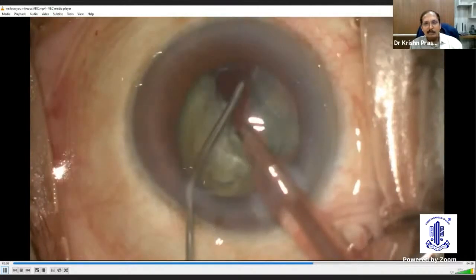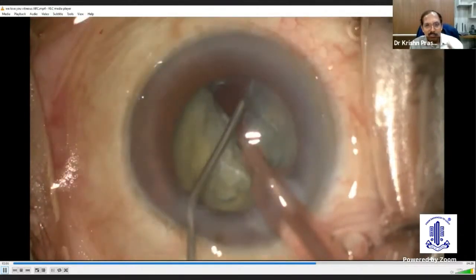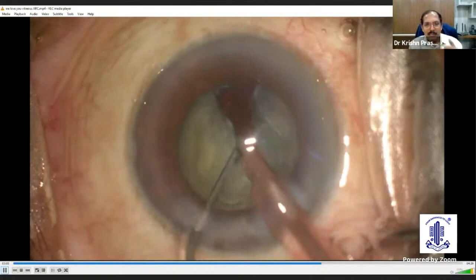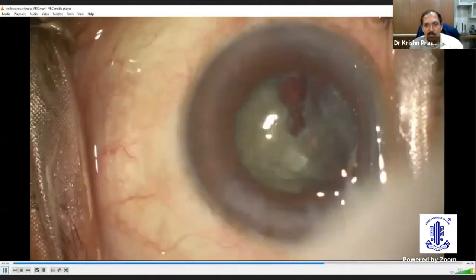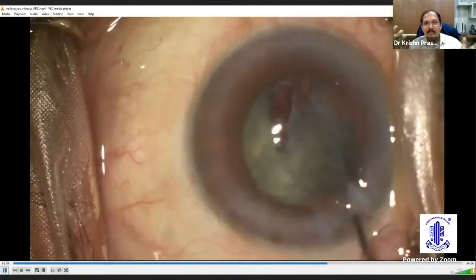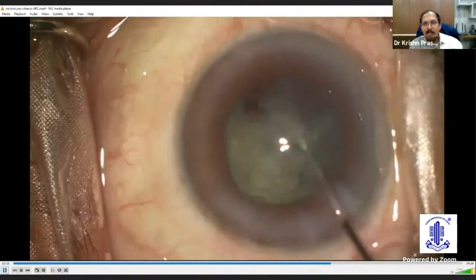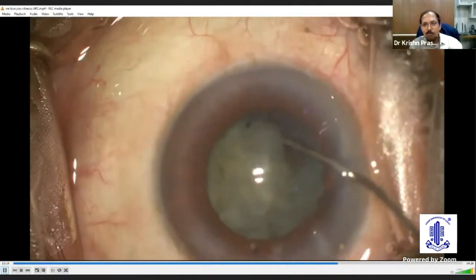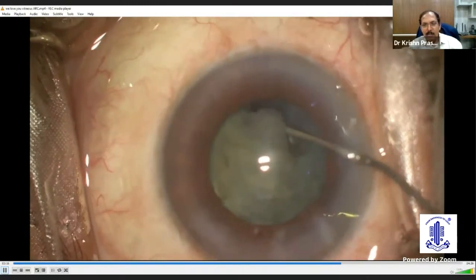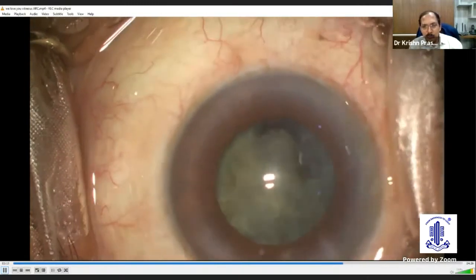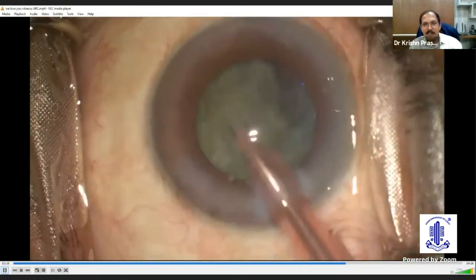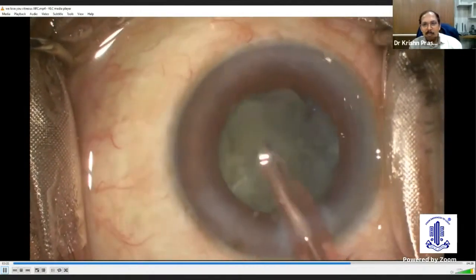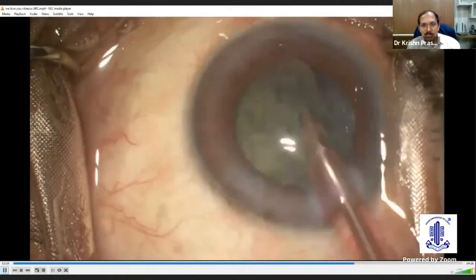He is trying to do the same maneuver, putting viscoelastic to fill the nuclear cavity. But it is just going down the drain, not lifting the pieces up. Without a vitreous scaffold as in the previous case, there is no platform to work from. He tries multiple times to create a scaffold with viscoelastic, but in vain.